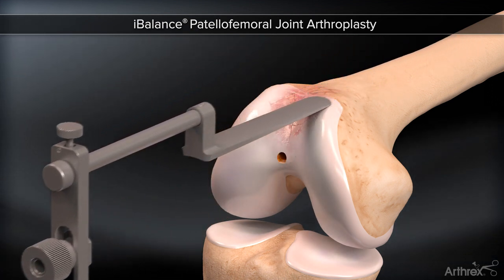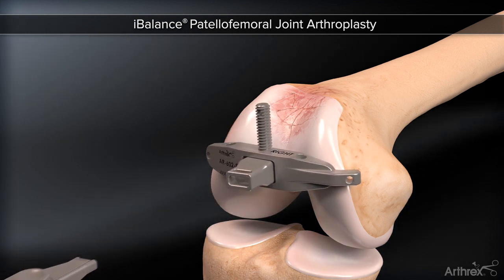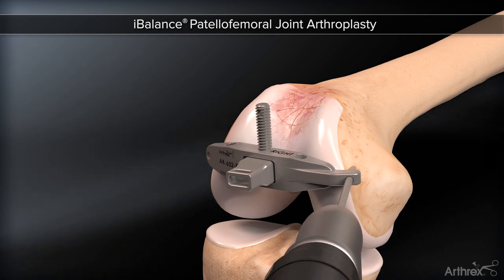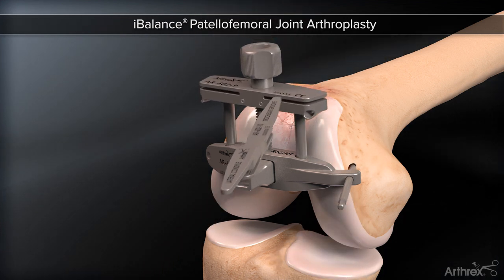The guide is removed. The side-specific base is inserted into the intramedullary hole. Rotational alignment is established and a pin is placed medially. The cutting guide is attached.